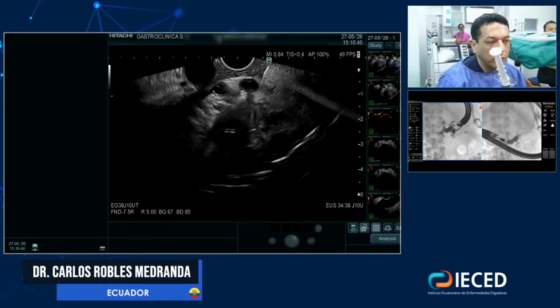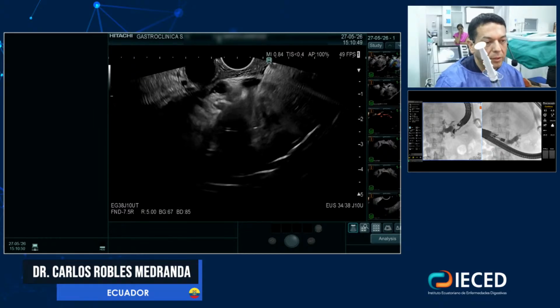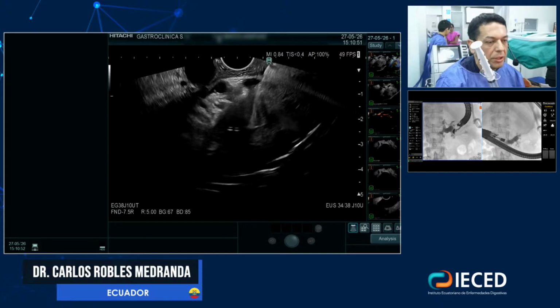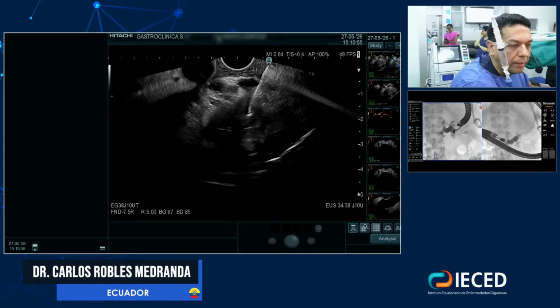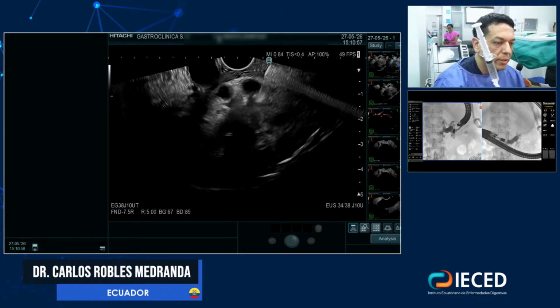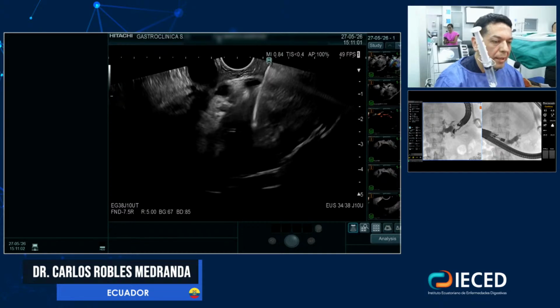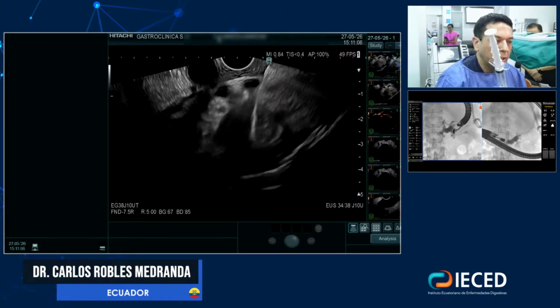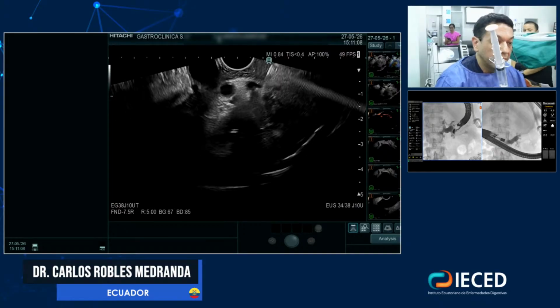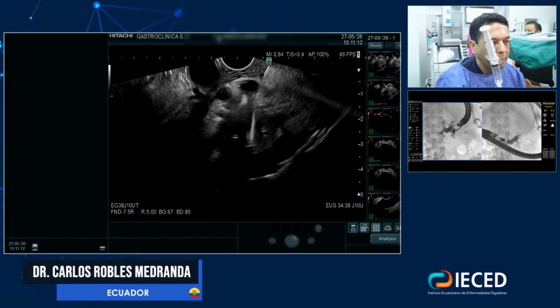However, EUS is very expensive as it's known right now, but it's really cheaper when you compare the techniques or the technology that we are using right now with endosound. I believe it can have a very nice and bright future, but we need to make studies, we need to discuss, we need to do a lot of things, so it will take some time.